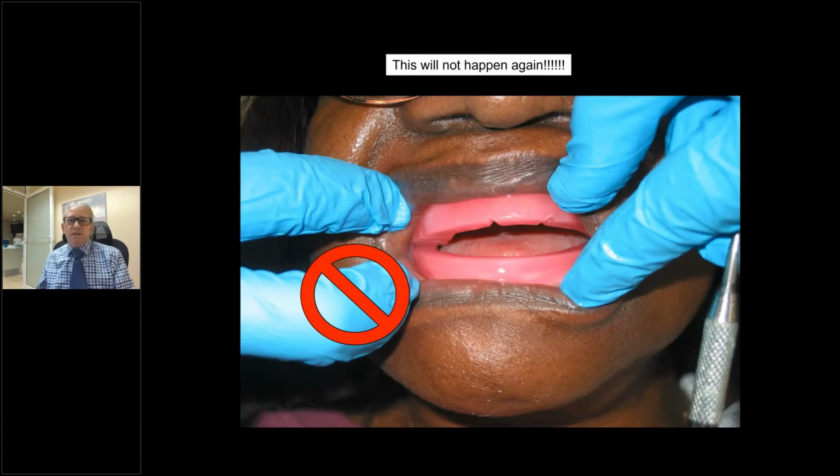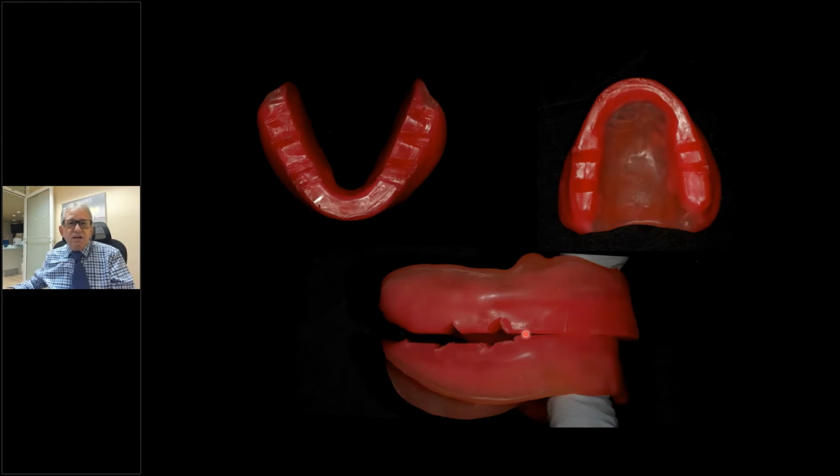This won't happen. And I know a lot of you have gotten occlusal rims that the laboratory makes 22 and 18, but they make it like normal. And what's going to happen is it's too long in the back. What's really nice, we're using the rim former. When I put this in here, the anterior is long, but it goes to 0 here. So you're going to see that the occlusal rim is not hitting that hard in the posterior section. It's only going to hit in the premolar areas. So here's what we're going to have. So now it's going to hit in the premolar area, and you're going to have this slight opening.